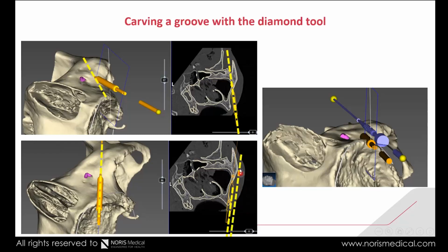This is the distance that we have if we take a tool, like let's say the depth probe, and we put it on, we lean it on the bone, above this line. If we look above this line, it's basically perpendicular to the zygoma bone. We'll see it in a different view later on. But we put it in here and we check this dimension.